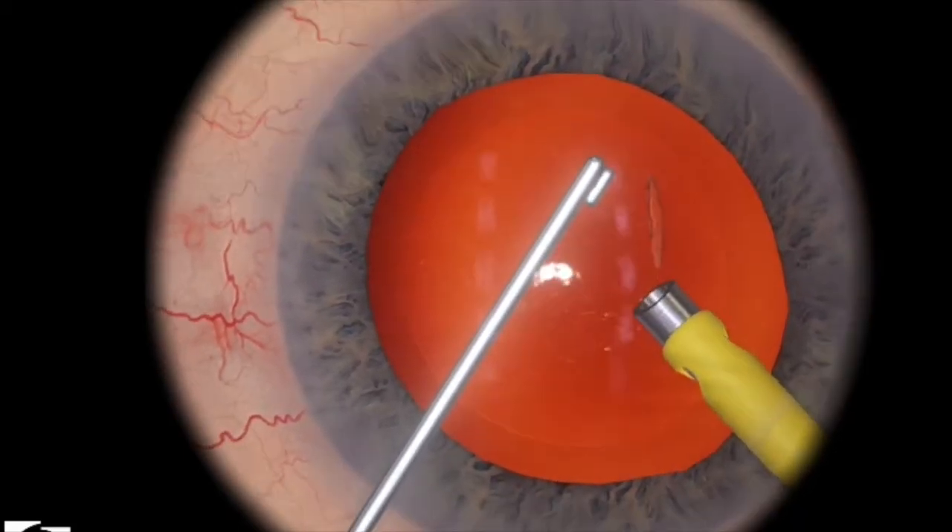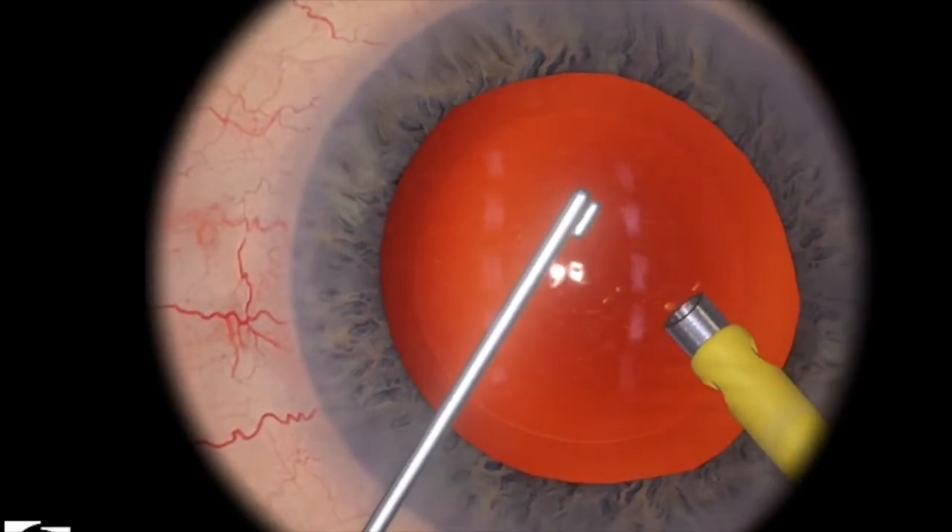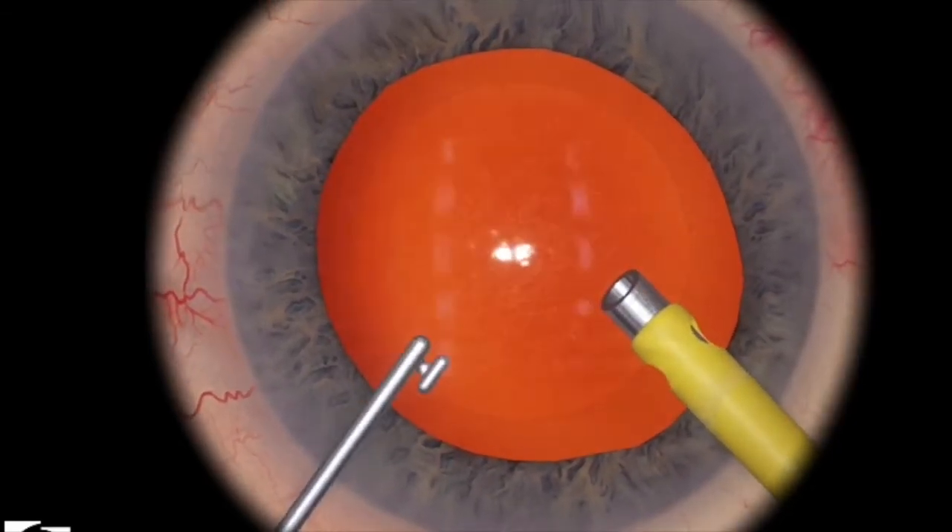Just be very careful with the smaller lens piece remnants, because you can accidentally engage the posterior capsule.